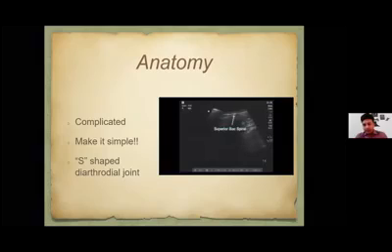Then you will see the posterior superior iliac spine. With a little maneuvering cephalad and caudal and a little tilting, you will be able to see the sacroiliac joint proper. Also, when you go down, you will be able to appreciate the sacral foramina S1, S2. We'll be coming to it, don't worry.